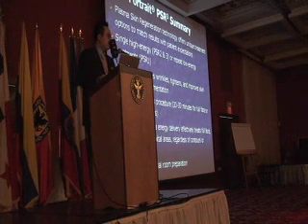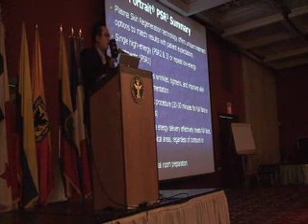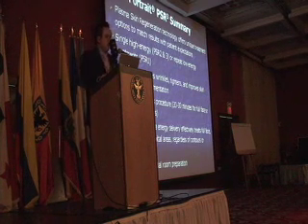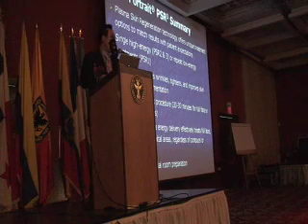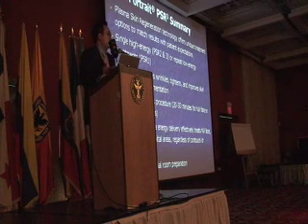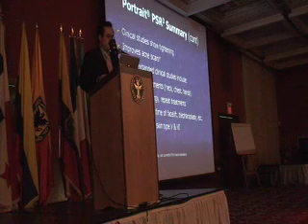It's an easy procedure to do, but you have to have good hand control because you don't want to burn the patient. You have to keep a non-contact distance during the whole delivery. There's also, just to reiterate, since I didn't stress this, no eyewear. Since this is non-chromophore dependent, it's a safe procedure. It's just basically nitrogen gas.